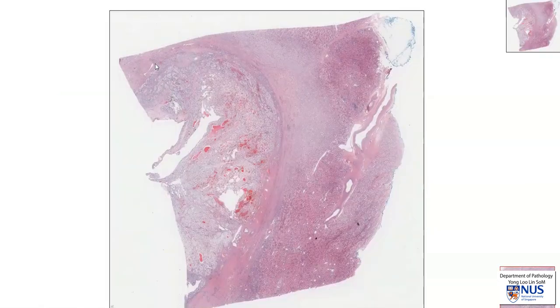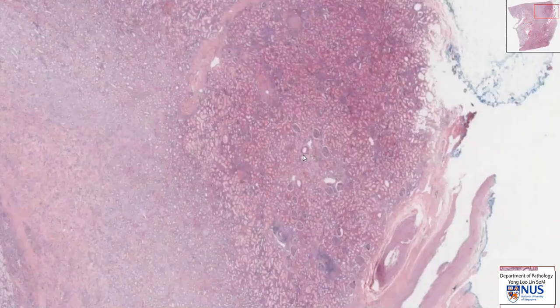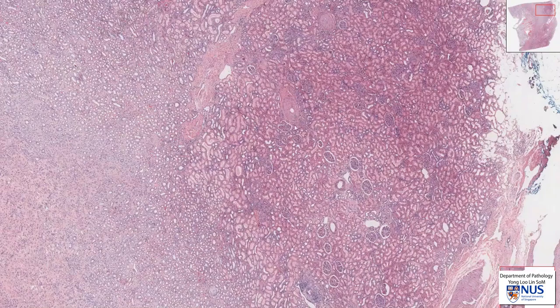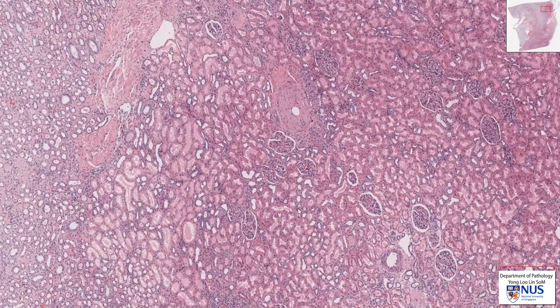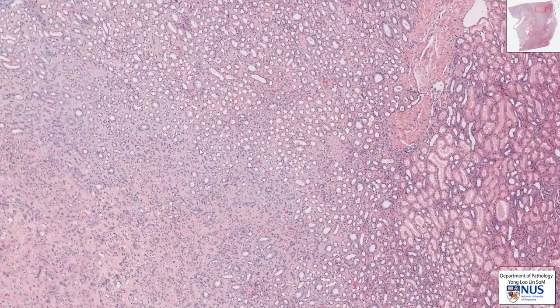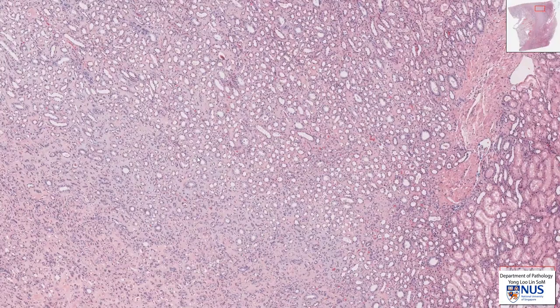This is a low magnification view. Here is the tumor, and here is the uninvolved non-neoplastic kidney. Just to recap a little bit on your histology, this is the renal cortex because we can see the glomeruli and some of the tubules here. The more obvious ones would be the proximal convoluted tubules with the rather pink-appearing epithelium. And this is the renal medulla with the collecting ducts.